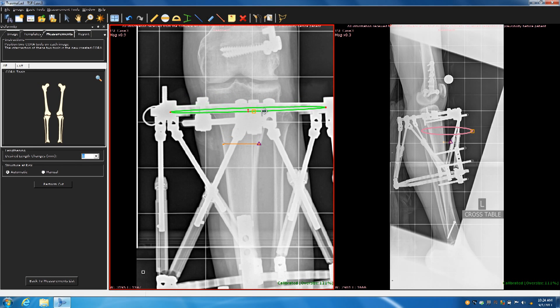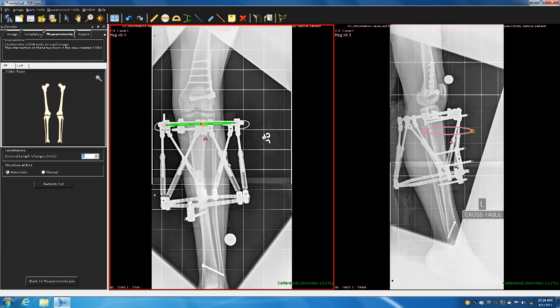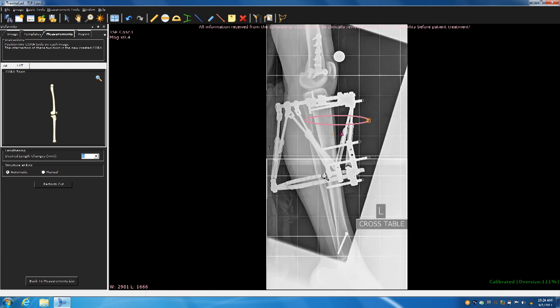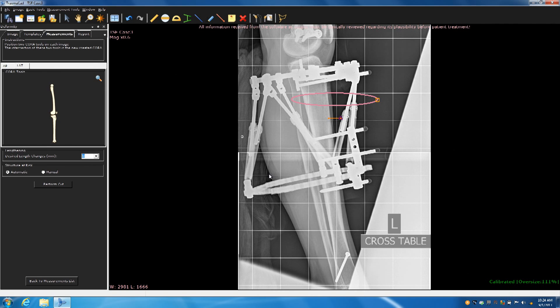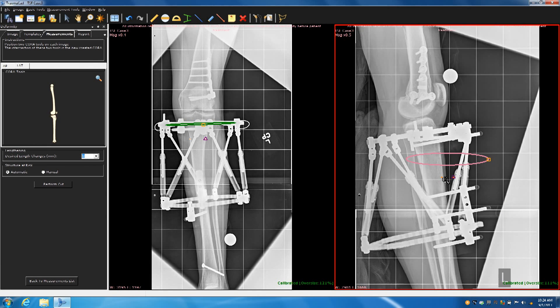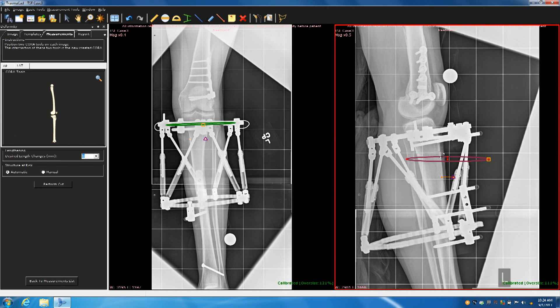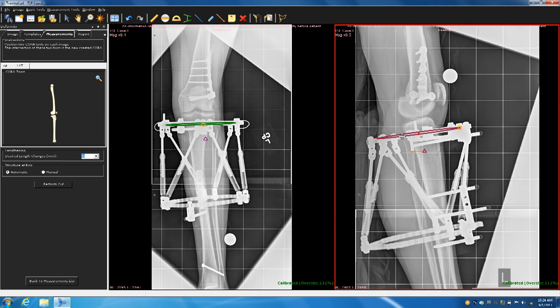When I grab my osteotomy, it moves in both planes. If I grab my ring, the osteotomy moves with it. Once you finish your AP, you go to your sagittal. If you want to concentrate on one image, just double-click it; double-click again to go back to both. Grab your little ring — you can toggle it, lengthen or shorten it, tilt it. This is a little bit of art in the middle of all these accurate measurements. This is the front of the ring where the tab is, where the second hole is, where the inner diameter is. Back in the day I would line up these bolts for mounting parameter shots — I don't do that anymore.